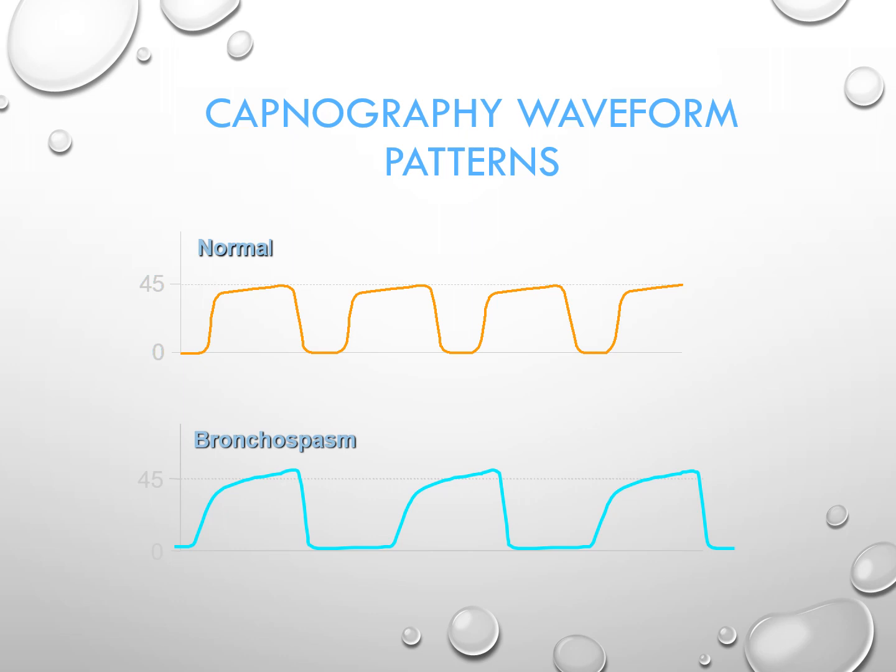Now I will tell you, again, that shark fin, I'm putting that in quotes, depiction is really saying the patient is having difficulty reaching a steady state because the alveoli are emptying unevenly and slowly. Therefore, that inhibits the ability to achieve that classic plateau. I'm going to call it a quasi-plateau. It's not completely flat, but it's almost flat.